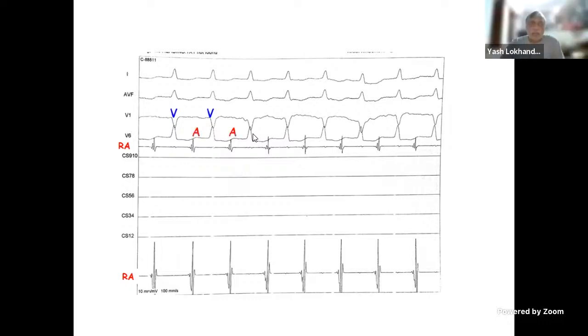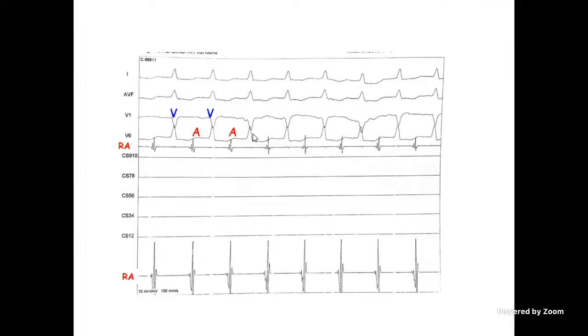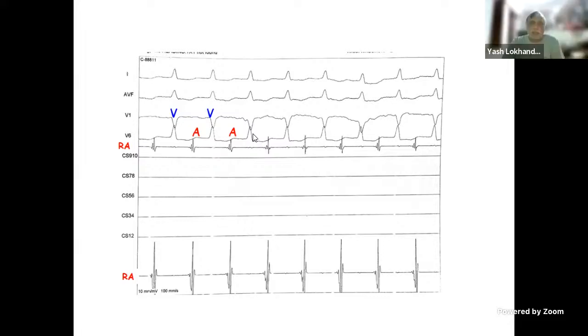Sriram, Umesh, you all should give the correct answer. Can this be a typical AV nodal reentry tachycardia? Yes or no? No, sir. No, it cannot be. So that point should be clear.